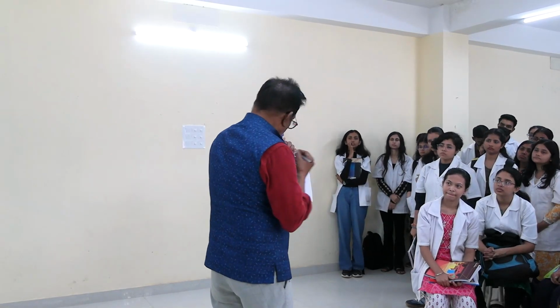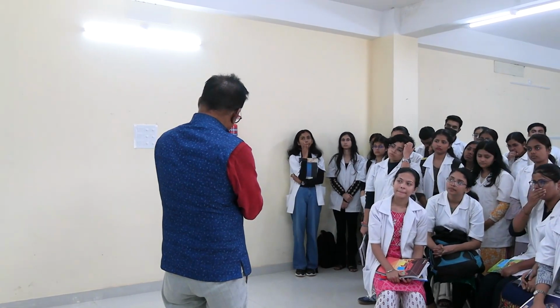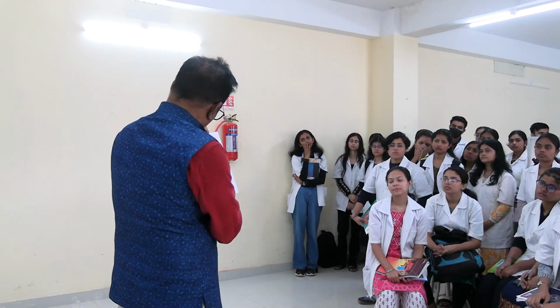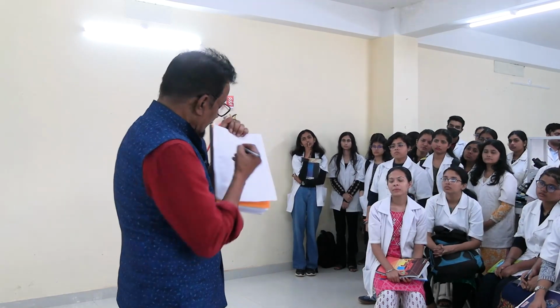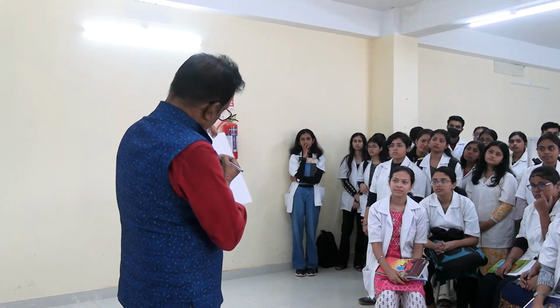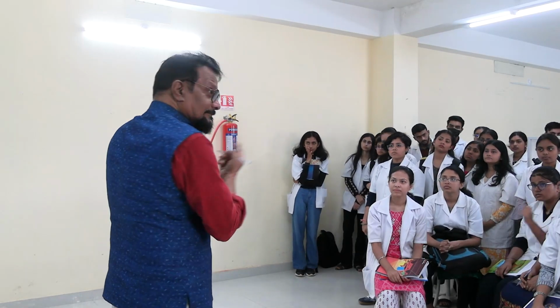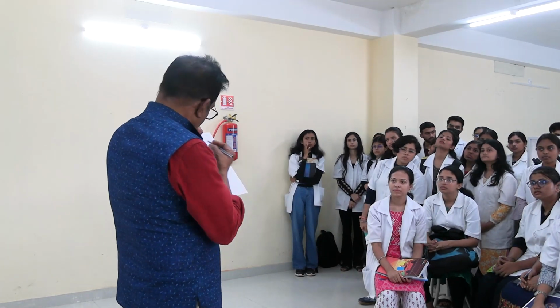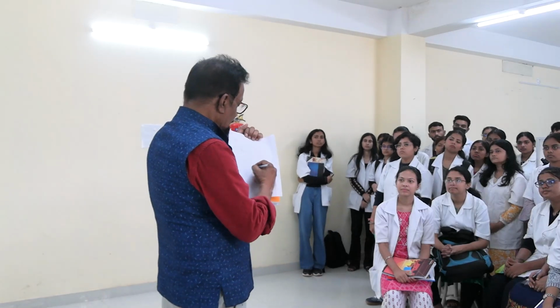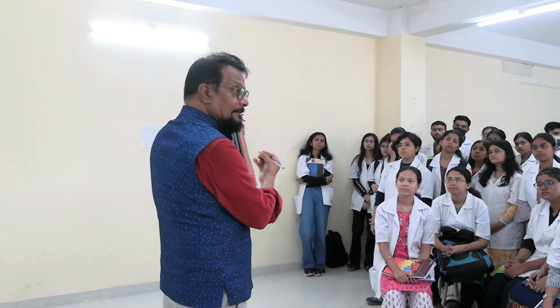What I did was, I saw 1, then I saw 2, then another 1, 4, then 2. So this is one across it. 1, then 1, 2. In this way I will be counting, and after that the total number will be 100.